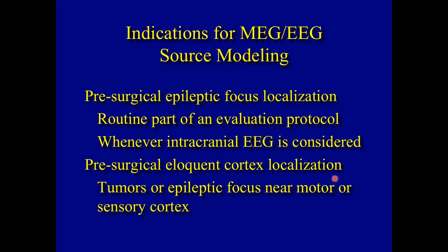The major one is pre-surgical epileptic focus localization. I personally feel that MEG should be part of a routine evaluation. We do MRI now, we often do PET, we often do SPECT, we often do this or that. MEG, I think, should be part of the standard evaluation. But if you want to be even more conservative, certainly MEG definitely should be part whenever intracranial EEG is considered.